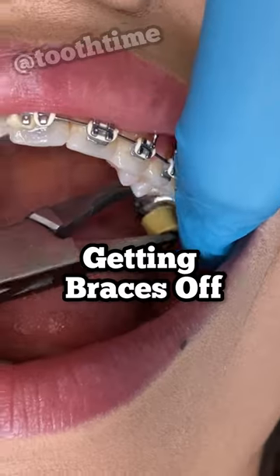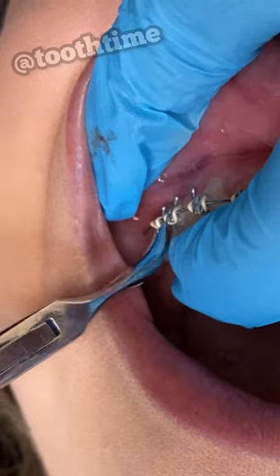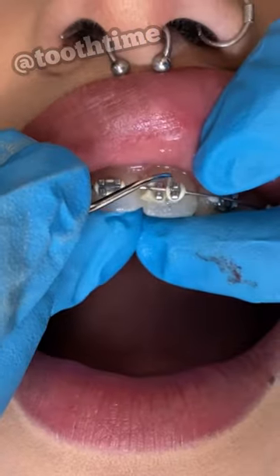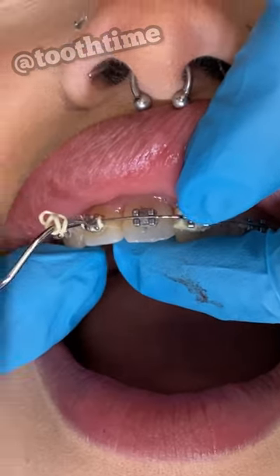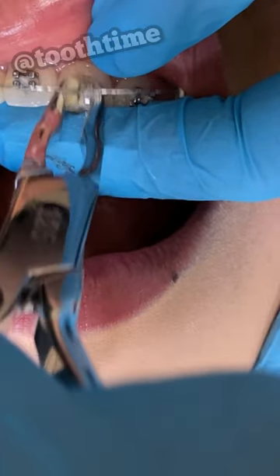Hey everyone, this is Abby, your hygienist here at Tooth Time. Today we will show you a speed process of taking off your braces. We're going to take off the molar bands, the brackets, and the colors. Once we take all of that off, we're going to go ahead and take off all the glue from the teeth.